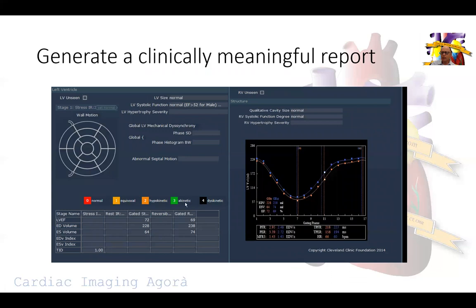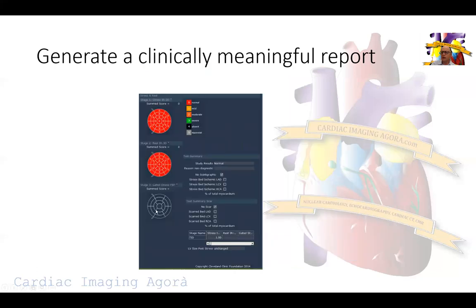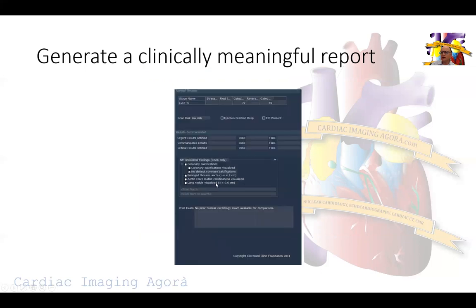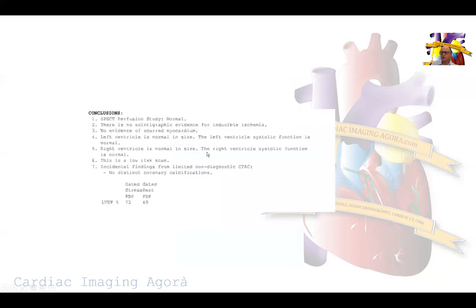We are doing pharmacological stress testing with regadenosine. The ejection fractions are populated by the software - normal ejection fraction at rest and post-stress, normal right ventricular function, normal polar maps all zeros, normal study, no TID, low-risk scan, no coronary calcification, and no prior study to compare to.